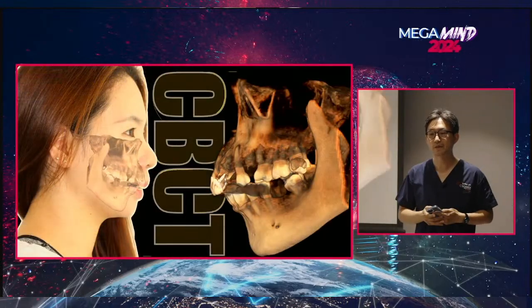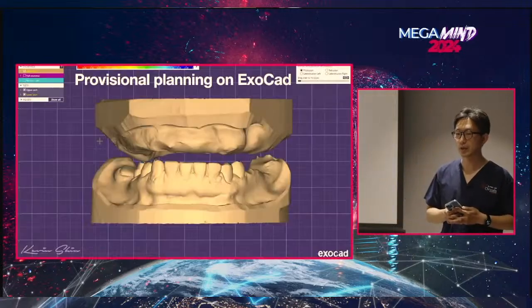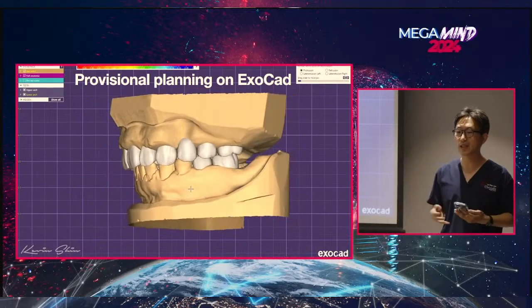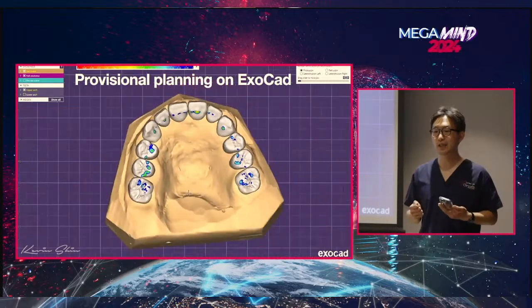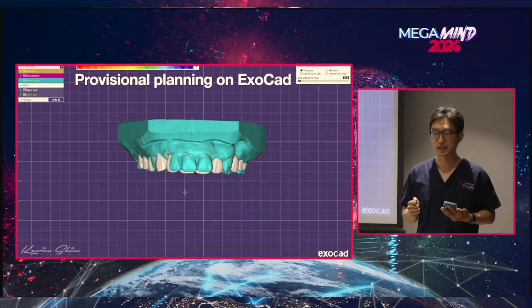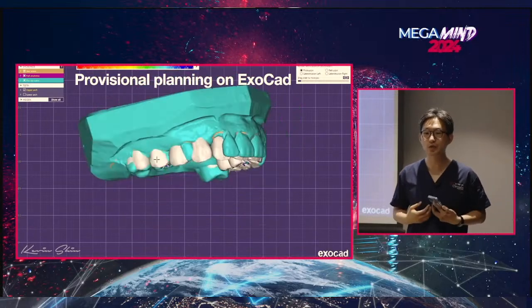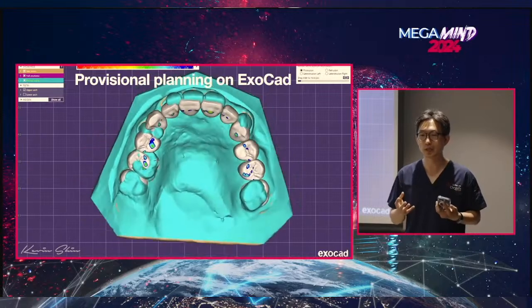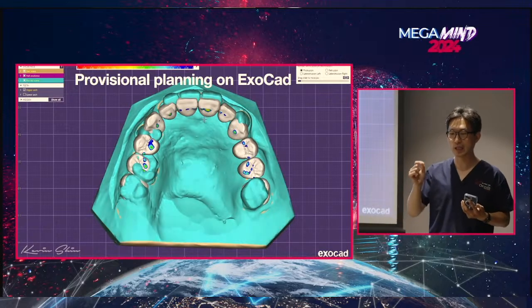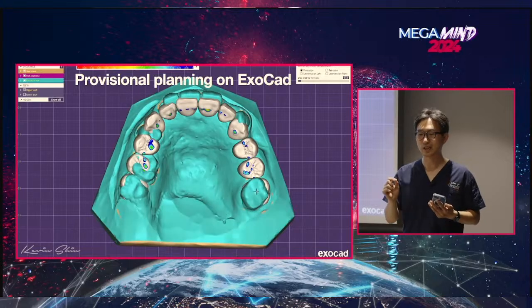And CBCT confirmed that her interdental bone level at the proposed implant sites had a good bone level for immediate implants and for MKFP1 prosthetics. And as we finalized our prosthetic design, we were confident that our MKFP1 treatment would be the best option for Randy. However, in order for my prosthetic plan to become reality, my dream to come true, our surgical team had to place 11 immediate implants as precisely as possible at the right location with proper depth control. And that is not an easy thing for any surgeon out there.